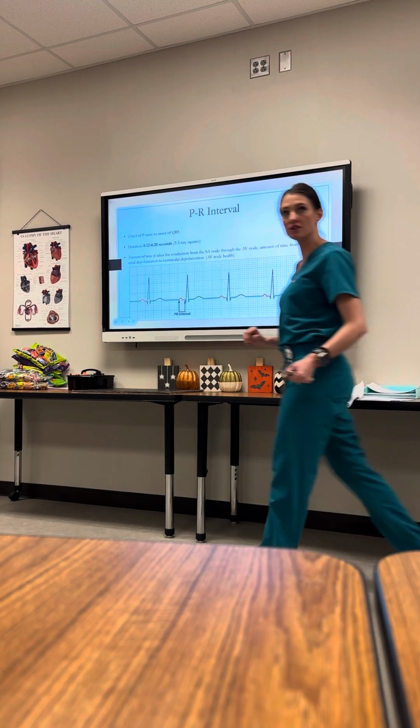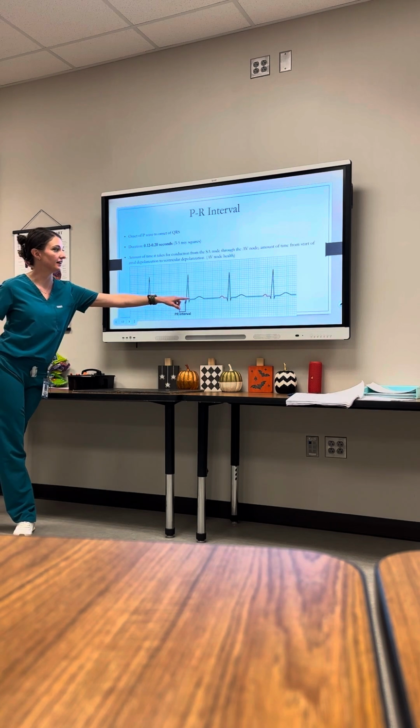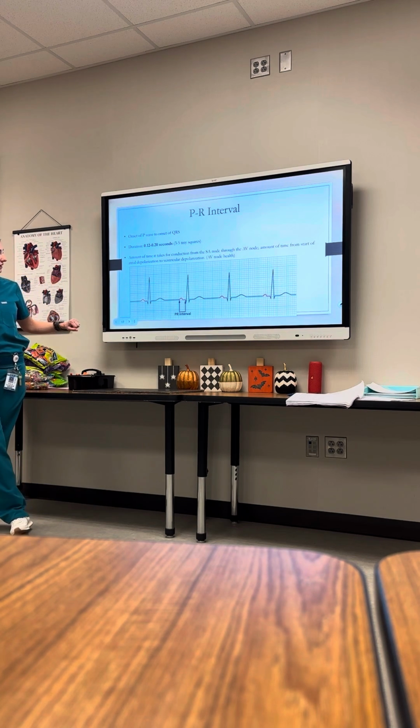Ready to label? Let's go back to 49. No, not yet. You can see that PR interval highlighted here in red. Let's go 49 and let's label it.